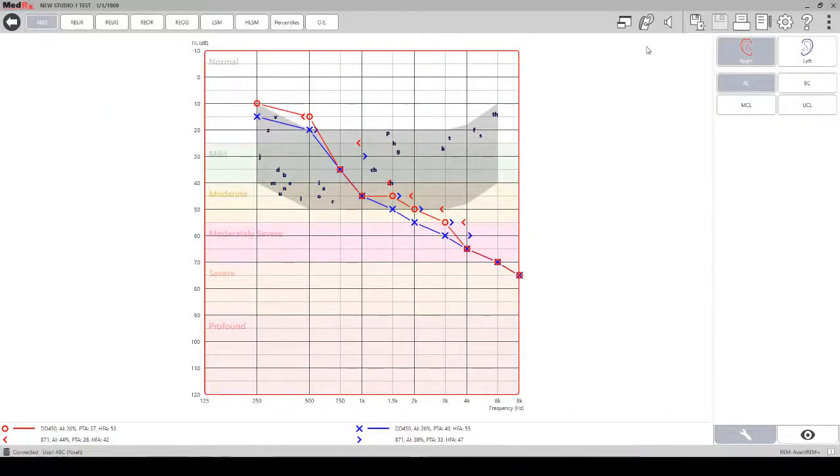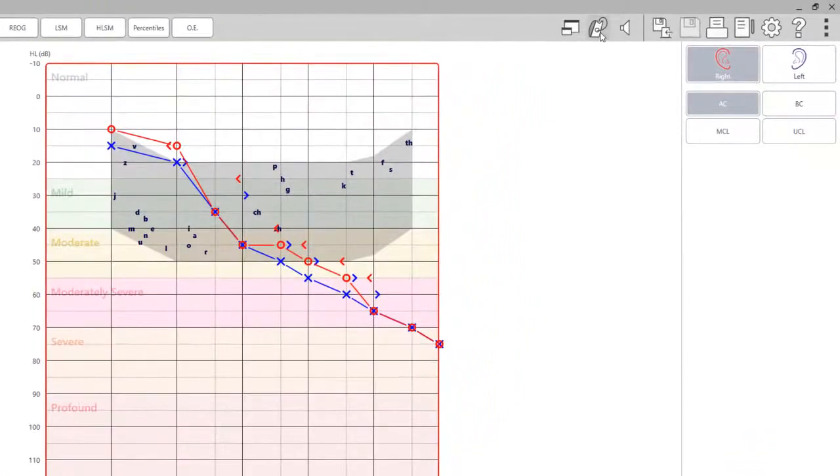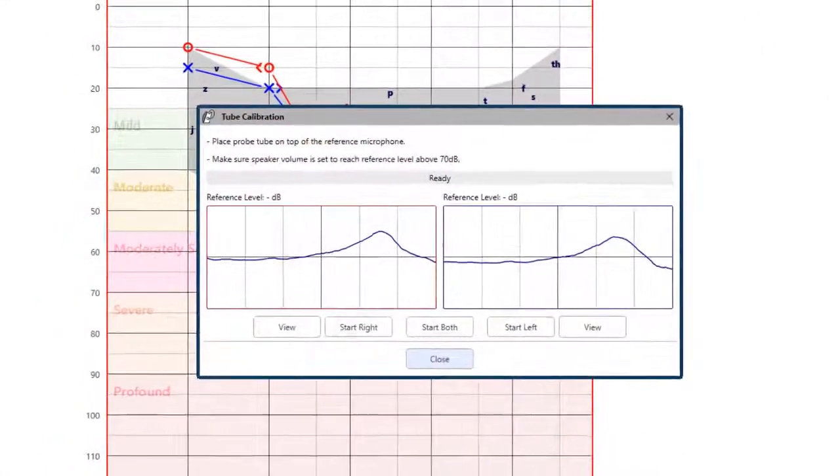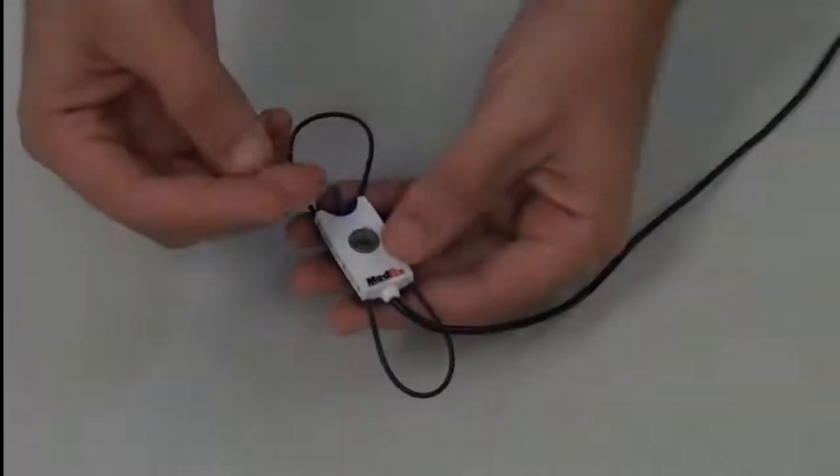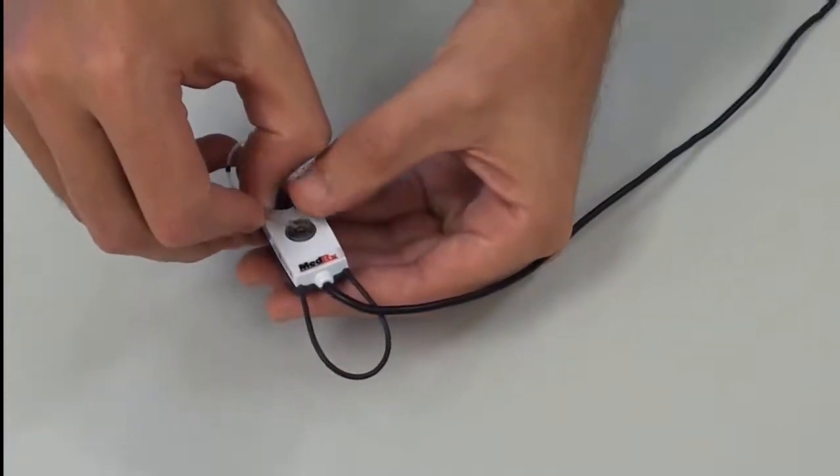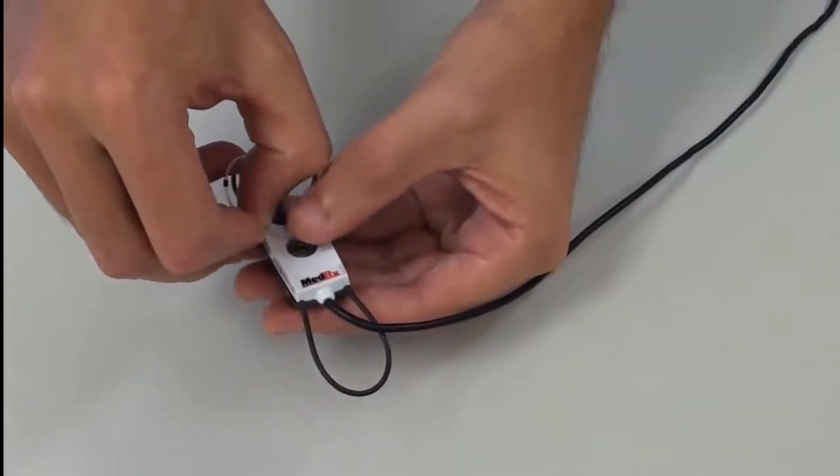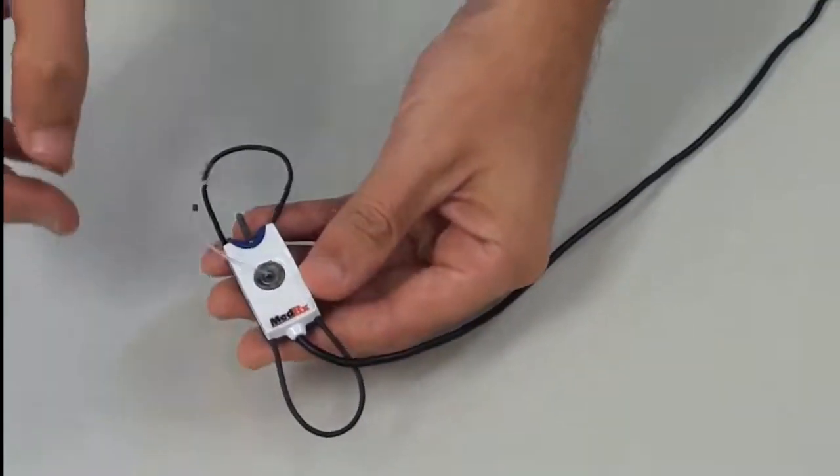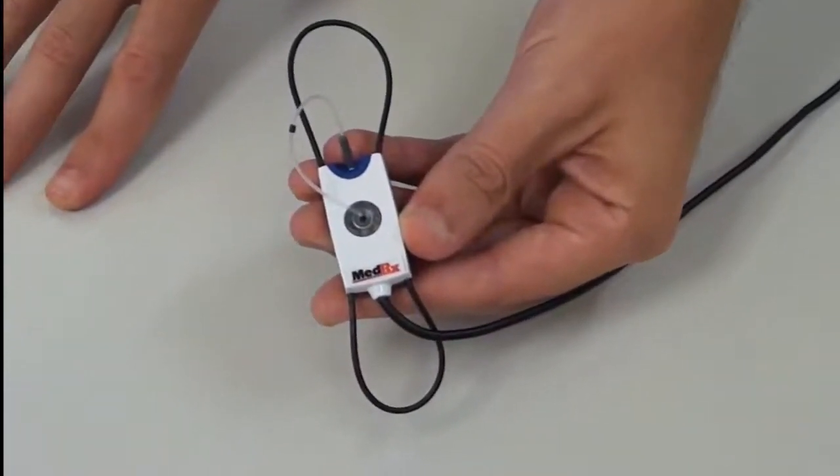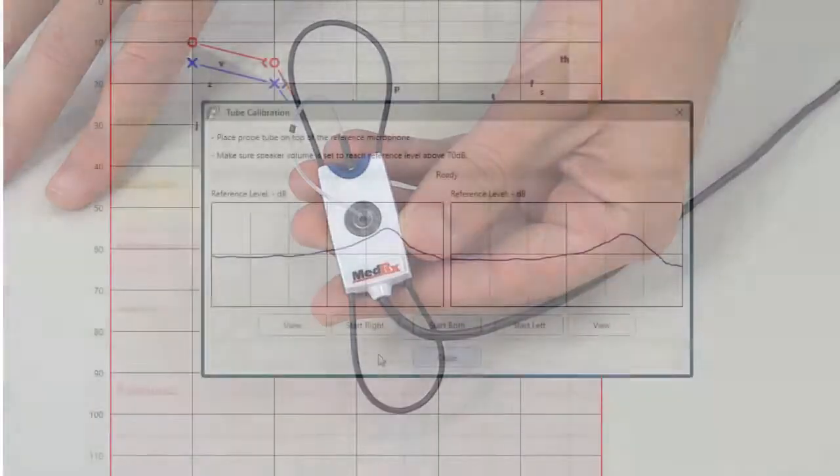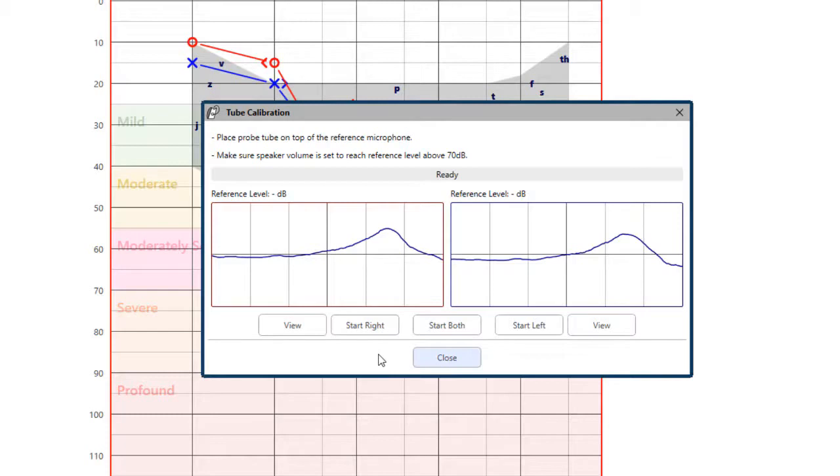To calibrate the probe tube, click on the probe tube calibration icon at the top of the screen. Place the probe tube between the calibration nibs on your reference microphone. Be sure that the opening of the probe tube is centered on the opening of the reference microphone. You can choose to calibrate the probe tubes individually or both at the same time. When you start the calibration, you will hear the calibration noise from the speakers.